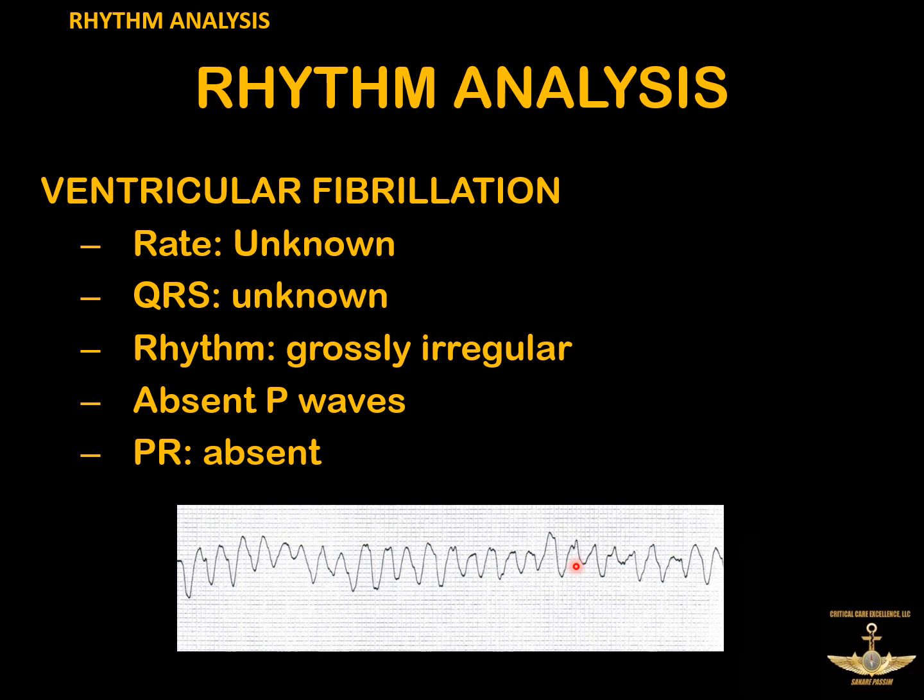And the caution I would give you here when looking at VFib, especially when you're doing testing, is apply these criteria every time. Every VFib is not going to look like what you see on the screen now. Some are going to be much smaller, some are going to be bigger. What you're looking for is that lack of rhythm and lack of everything else that you've been looking for, and that's going to point you toward VFib.